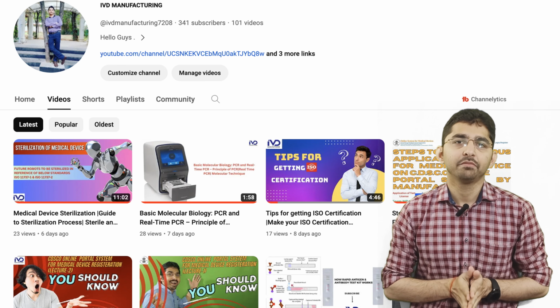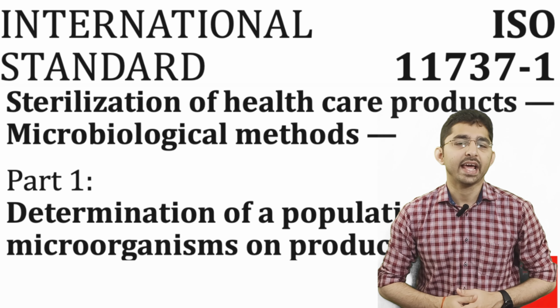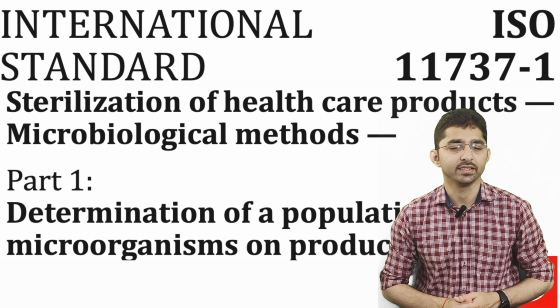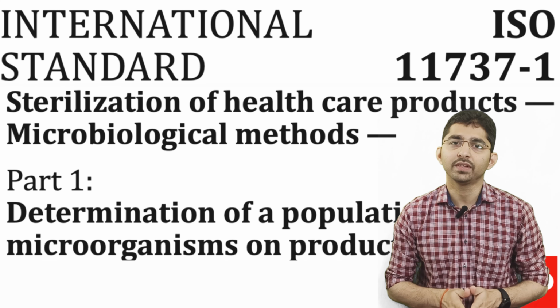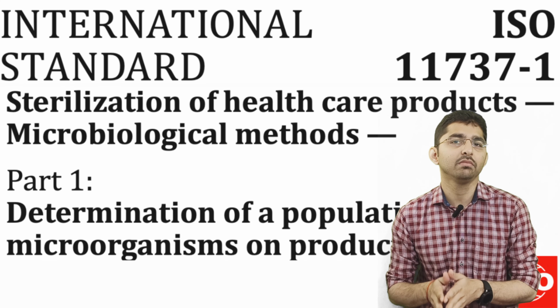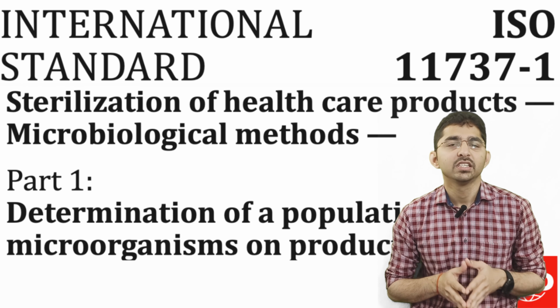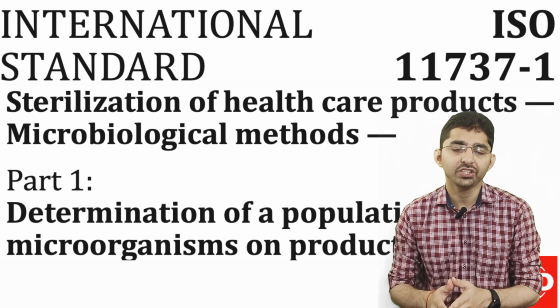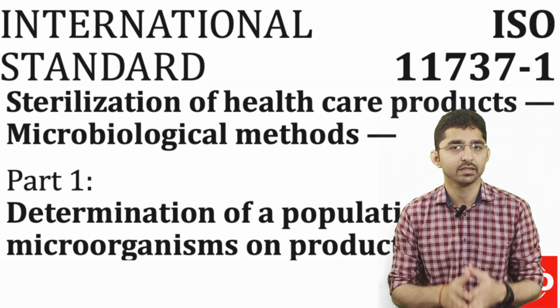So today I have brought a lecture on a topic called ISO 11737-1:2018. This standard is mainly for the sterilization of healthcare products based on the microbiological method. Part 1 speaks about the determination of a population of microorganisms on the products.